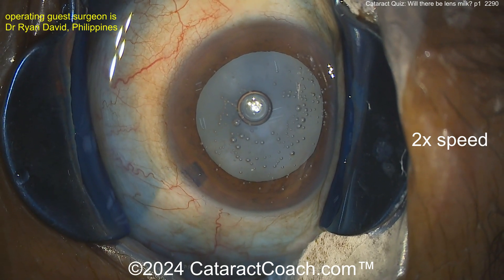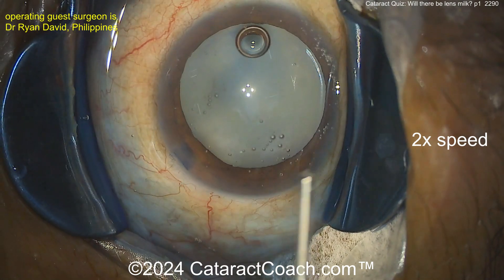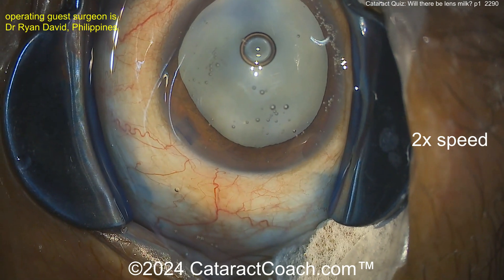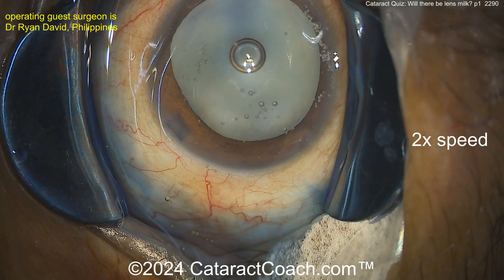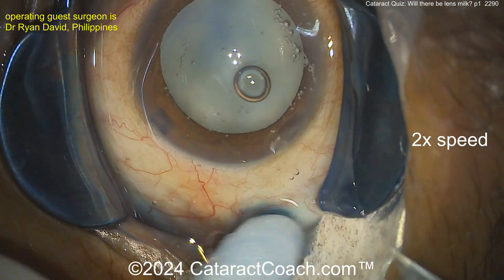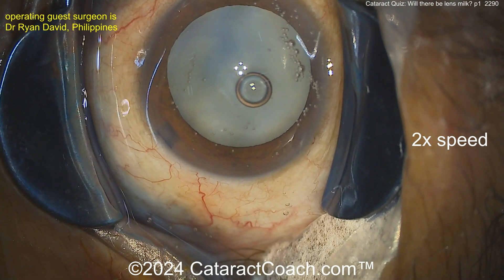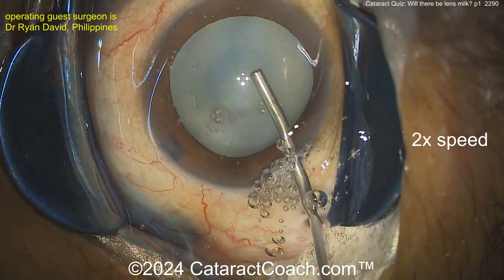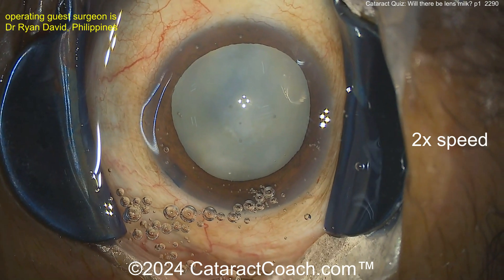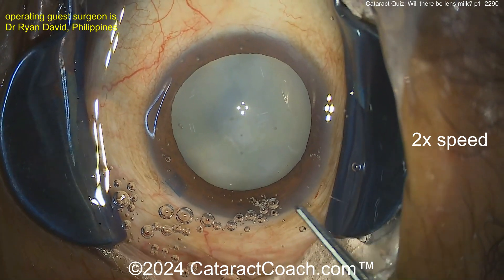If you poke into that lens capsule, are you going to get some lens milk? One of the things I've shown you in the past is we can actually touch that lens capsule with the cannula as you put the viscoelastic in - does it feel pressurized? Does it feel like the bag or the anterior lens capsule is bouncy? Let's see the main incision being made. More viscoelastic going in. I like to touch the capsule, and now let's go in with the forceps.